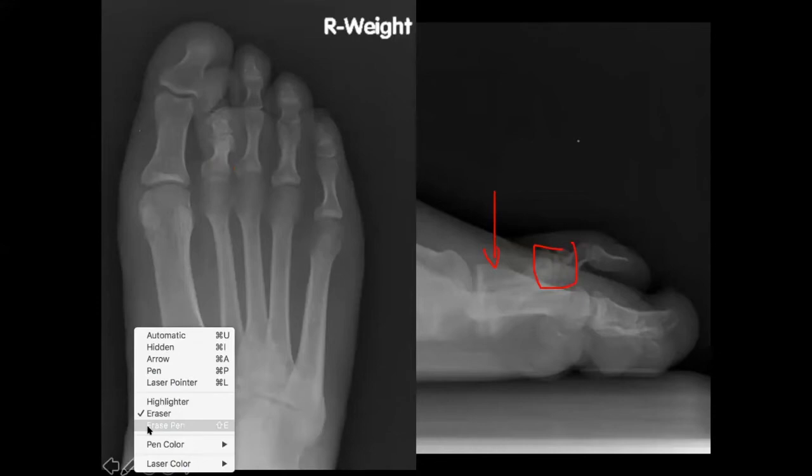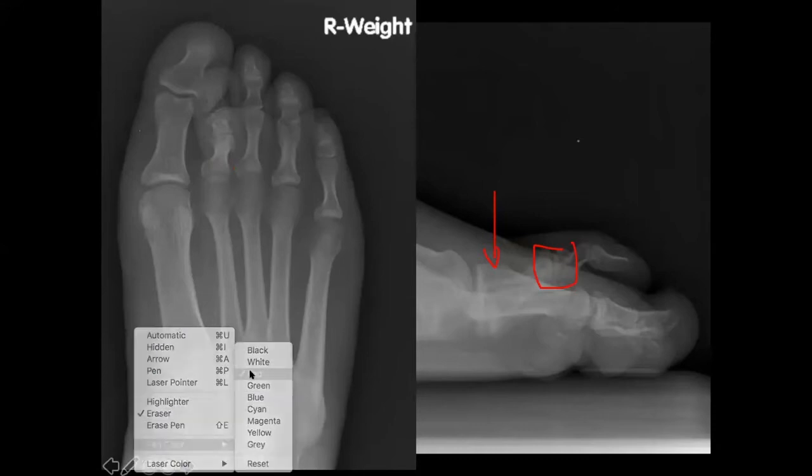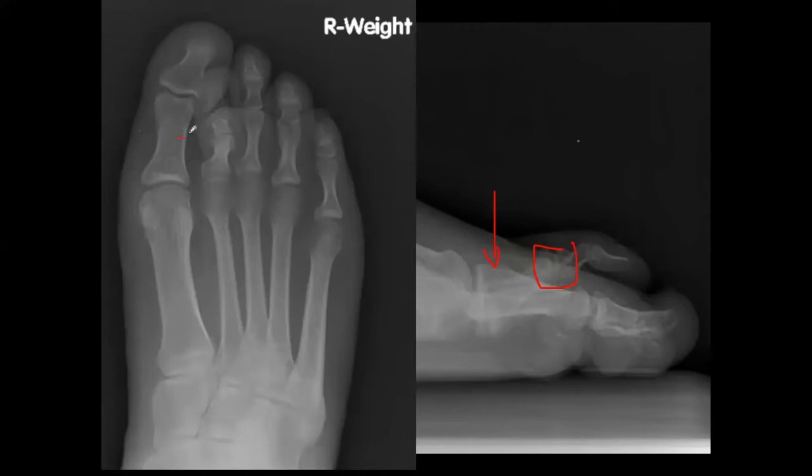How do you know it's an arthroplasty? The patient didn't know what they had done — they said they had surgery a long time ago. We see only part of the bone. All the other phalanges are very distal at their PIP, and this is just missing part of it. What happens when you cut bone? What will the bone do at the amputation site? Hypertrophic ossification — it's growing out there. That's why it kind of looks like a little fake proximal phalanx head.